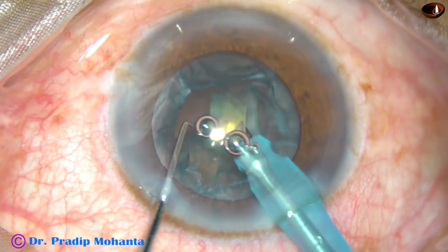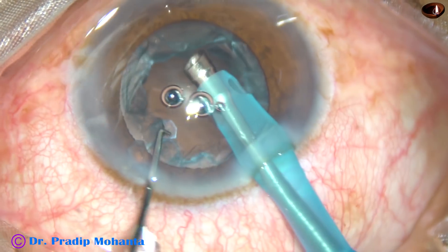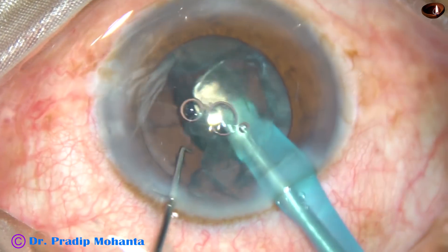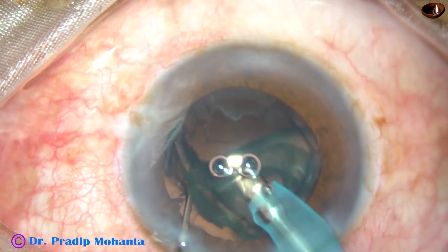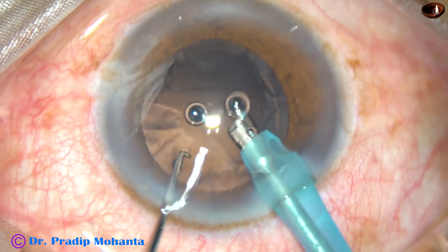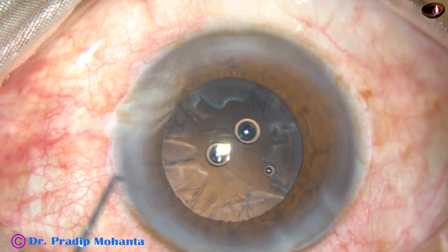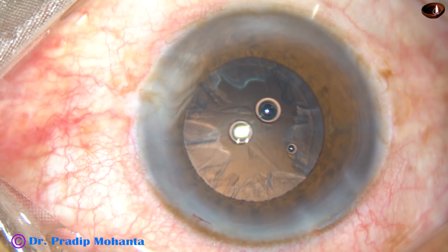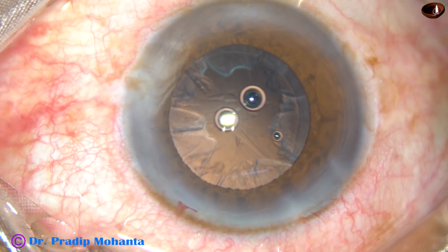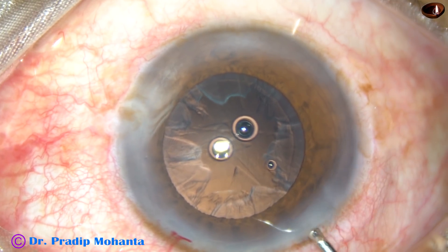The phaco power required in this case is very less — about 30 to 40 percent. Vacuum is 350 millimeters of mercury. Flow rate is 45 ml per minute. And that's it — the nucleus and epinucleus have been managed.